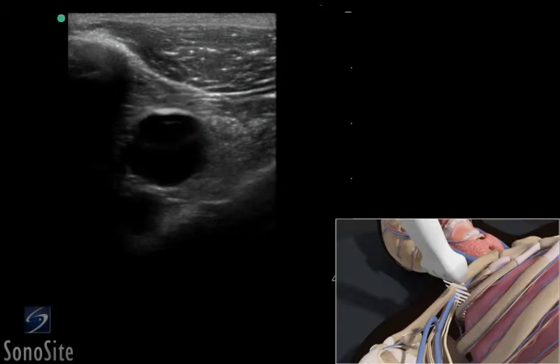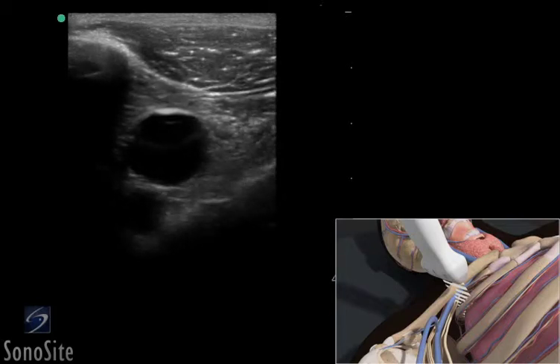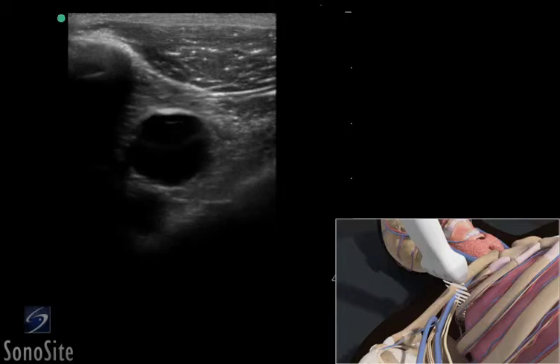A linear array transducer with a venous exam type is used to perform an ultrasound guided insertion of a subclavian vein catheter via a transverse approach.